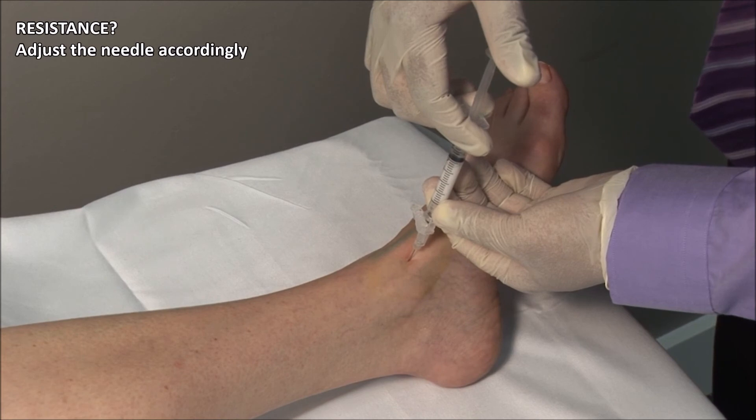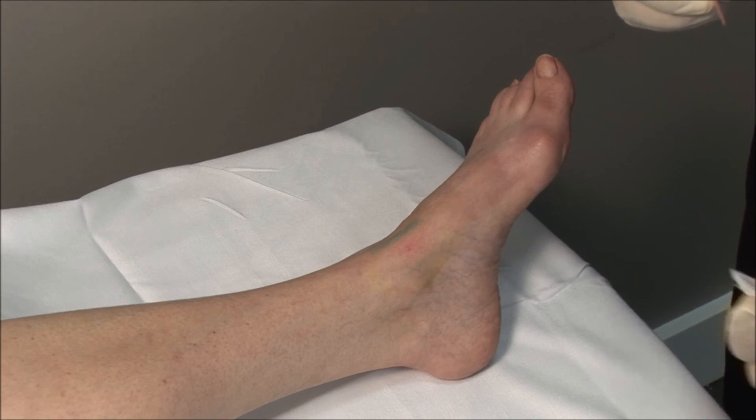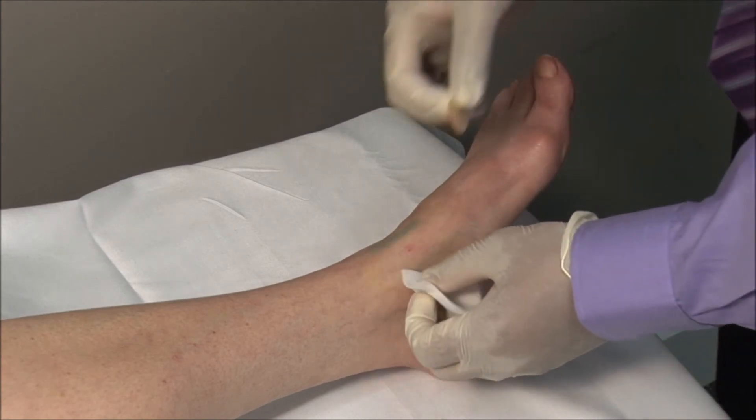If there is any resistance, adjust the needle accordingly. Dry the area and then apply a bandage.